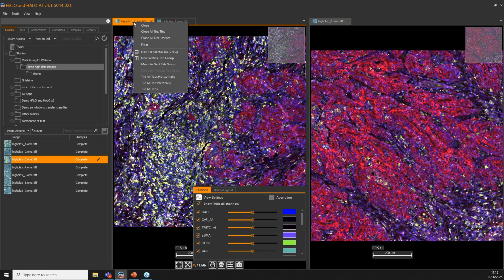So I'm just going to focus on that image and close all tabs but this one.